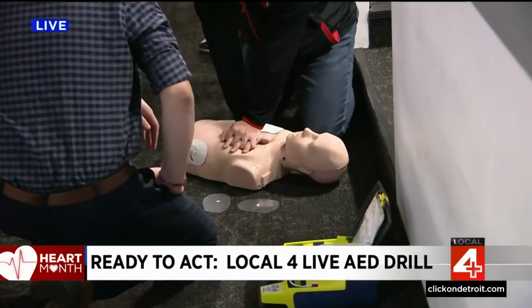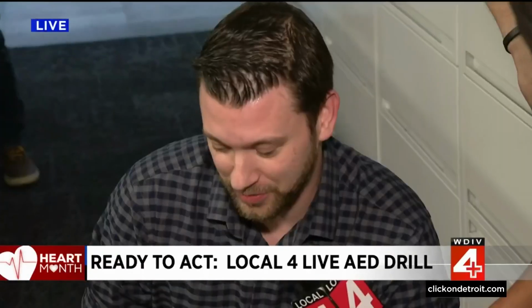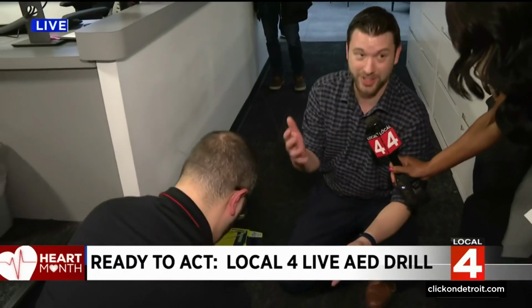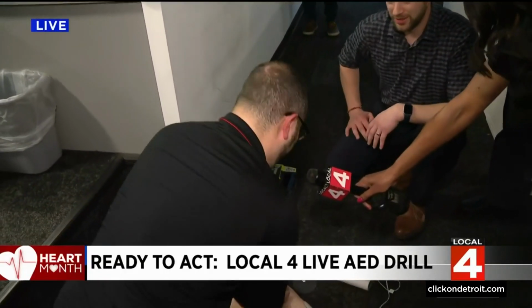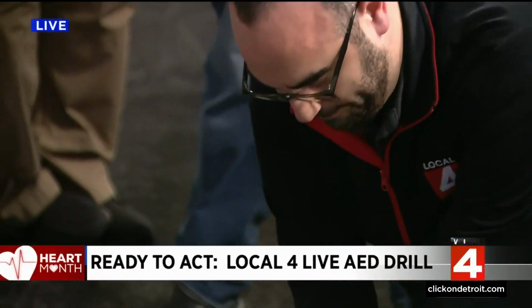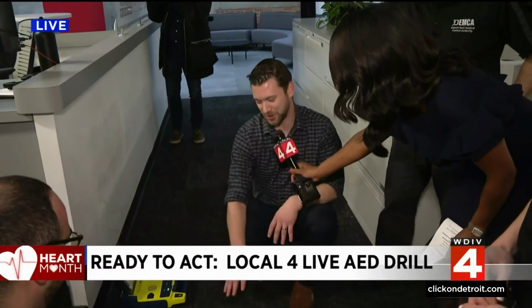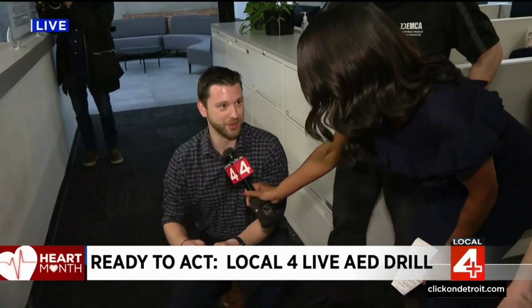Ben, do you want to share at all what this was like? I see you kind of perspiring a little bit. It was a little tiring, just like we prepared for. You definitely have the adrenaline running, and having a person ready to rotate is a big help. That was really big. I would say that's very important. This is kind of a hard workout, right? It's a lot of cardio. I'm burning a lot of calories. One thing I noticed is some confusion with getting the stickers off. Yeah, because I wasn't prepared to have 2 AEDs going at once, so this was a little confusing. I wasn't sure because we practiced so much without taking the actual stickers off, but this time it was ready to go.